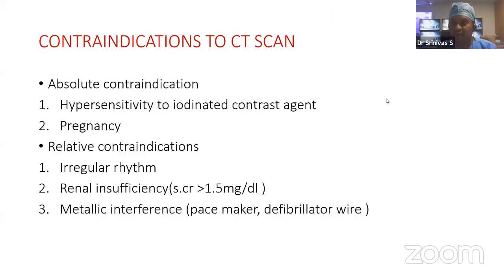So, contraindications of CT scan: hypersensitivity to iodinated contrast agent and pregnancy are the absolute contraindications, and irregular rhythm, renal insufficiency, and metallic interference would be the relative contraindications.